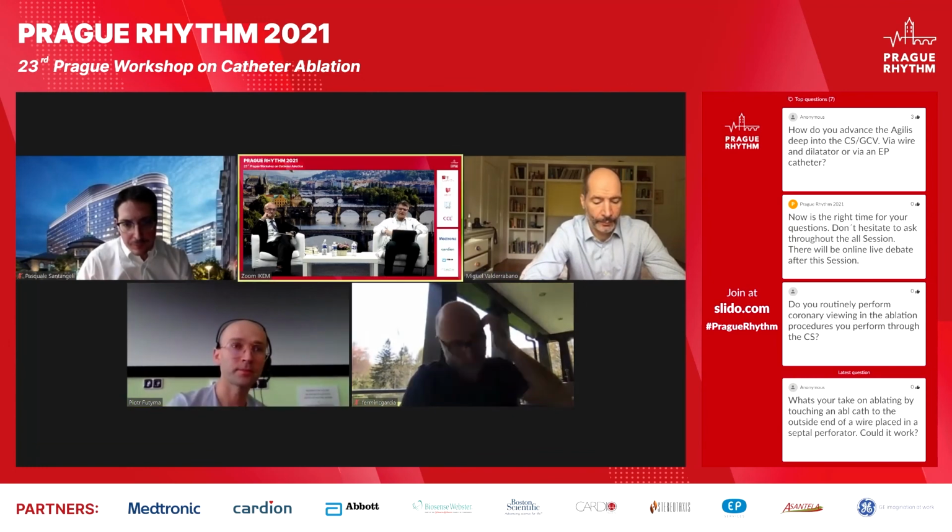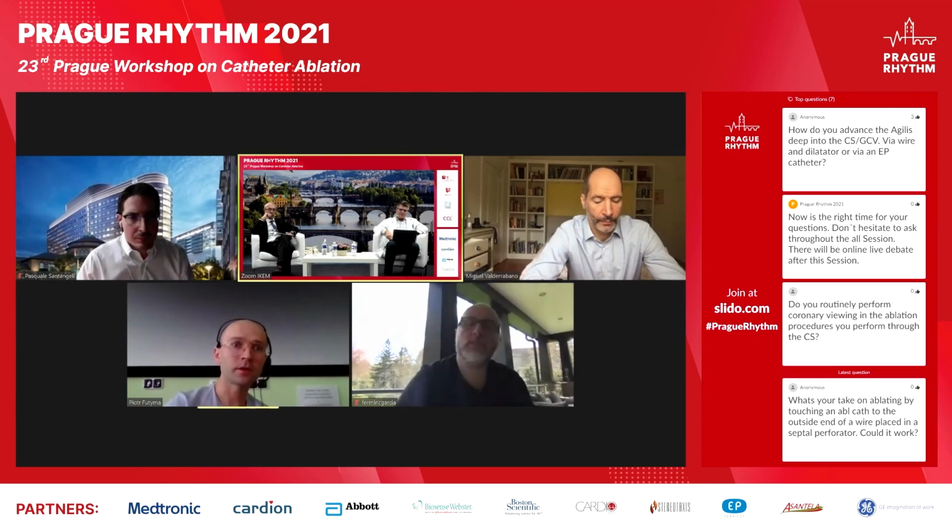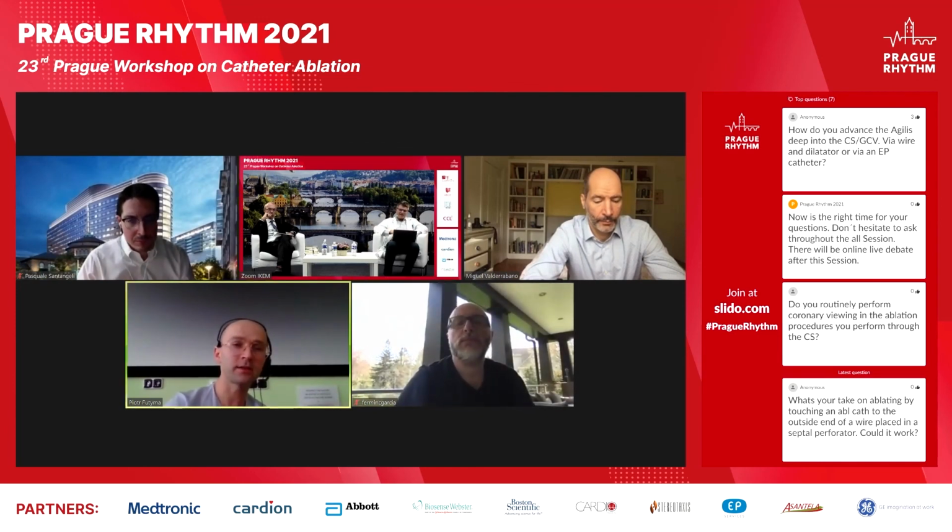All right, thank you. And what about, for example, a resistant mitral isthmus line to ablate with bipolar? Because we did one case a couple of years ago. It was a first in human experience, and it was successful. Do you have any? Yes, well, it was basically the initial concept for radiofrequency ablation. The first lateral WPWs were performed in bipolar fashion.